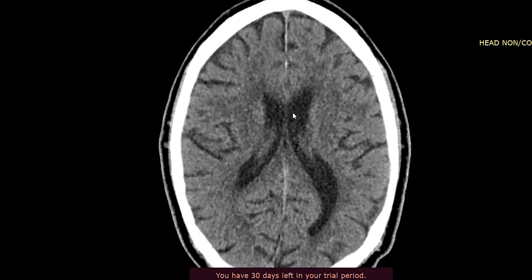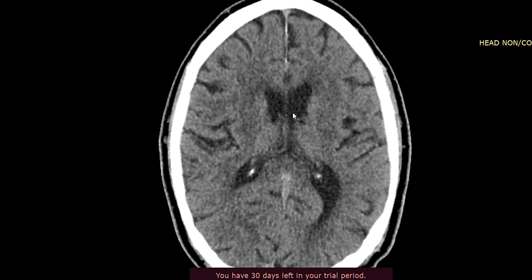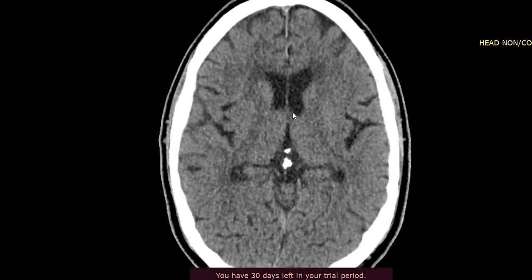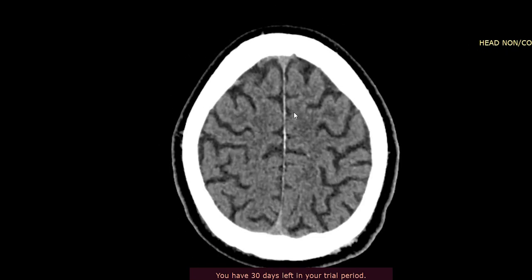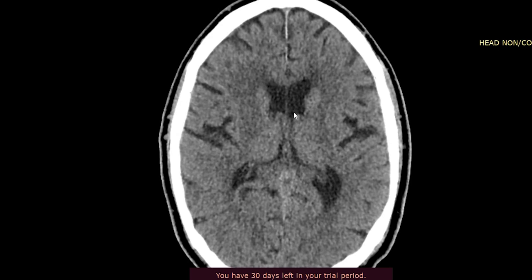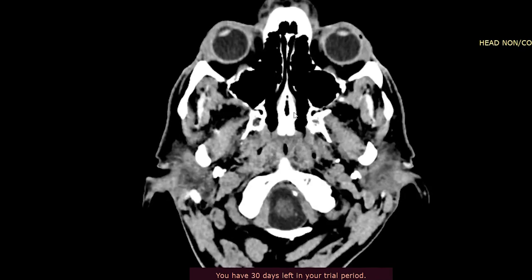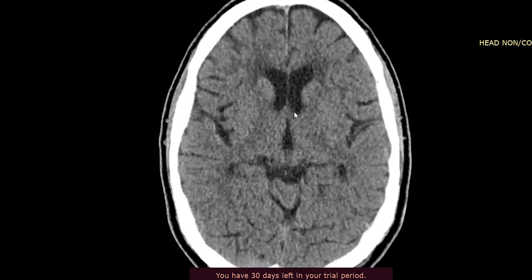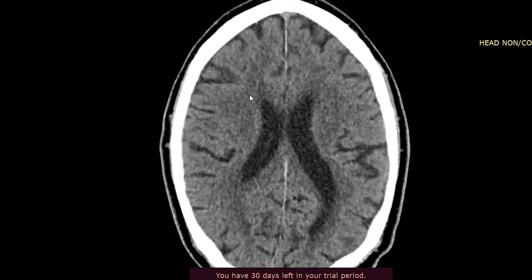We also want to have a look at the ventricular size as well, just to make sure they're not too small or not too big. As we know, as patients get older with generalized volume loss, the ventricles will start to get larger than they would in a child. These ones look age-appropriate, which is good. So we've looked at the ventricular caliber and the sulcal pattern — both look age-appropriate.